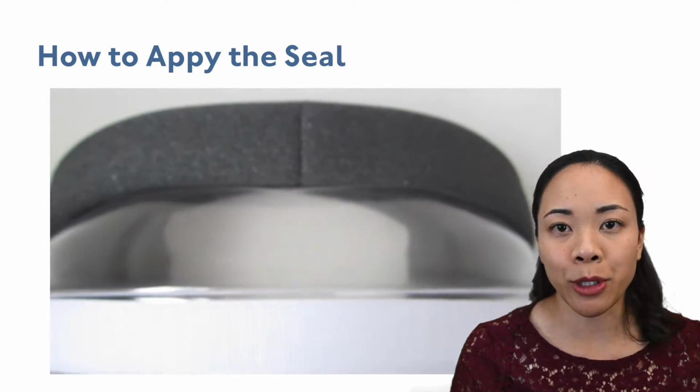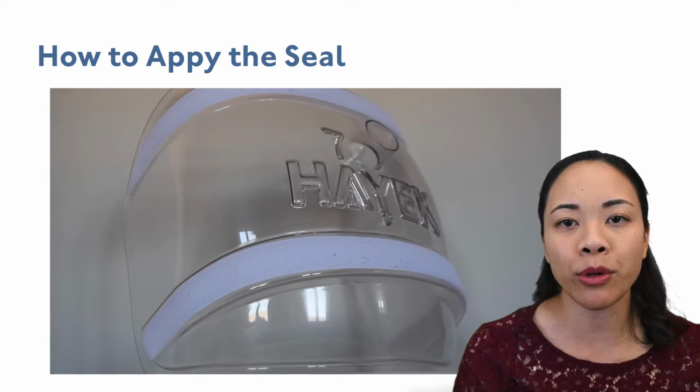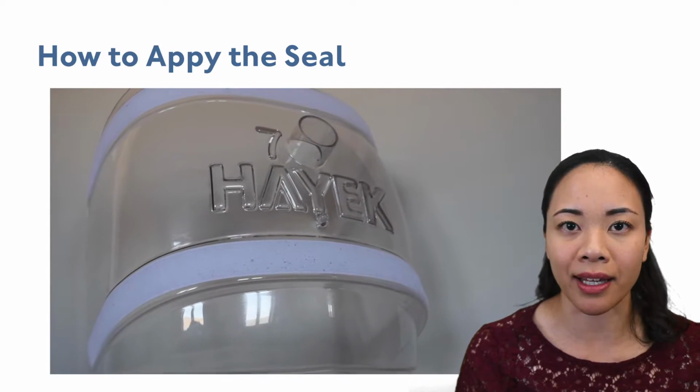Now let's attach our blue pressure sensor tubing to the port right below the letter Y of Hayek and the widebore tubing right above the Y of Hayek.